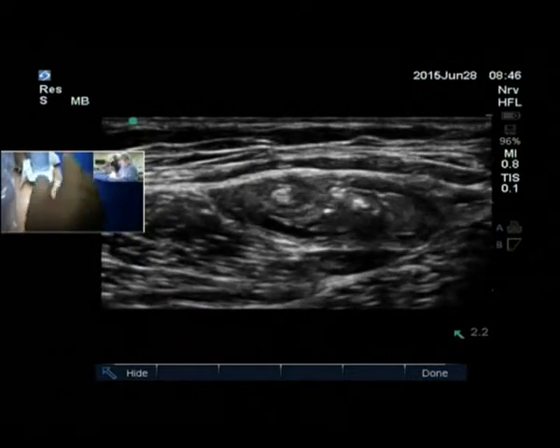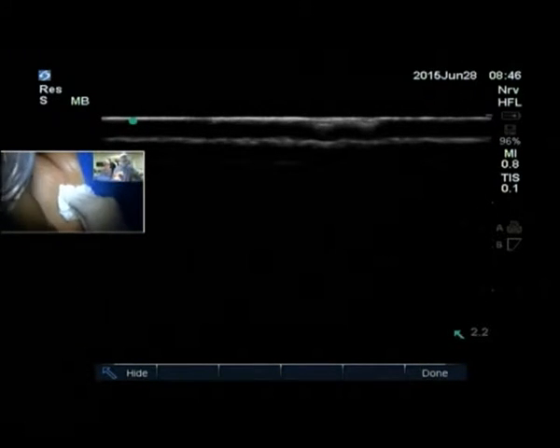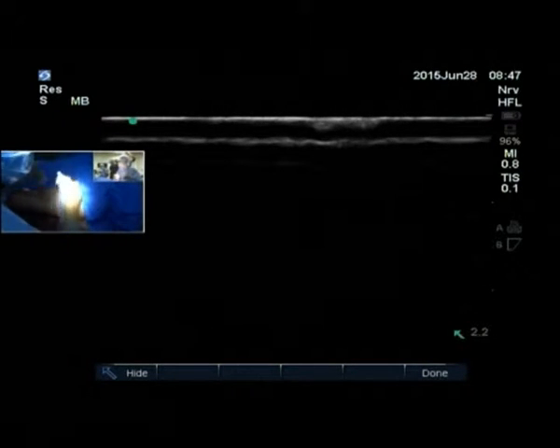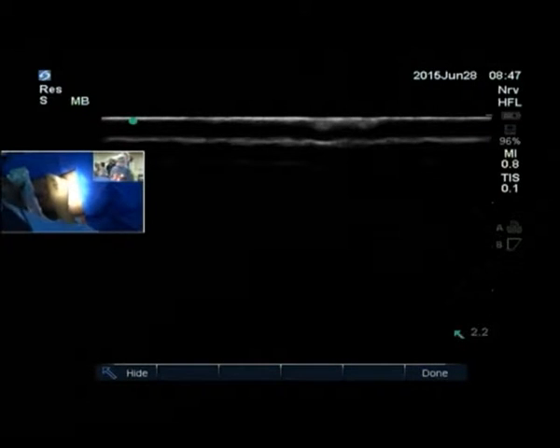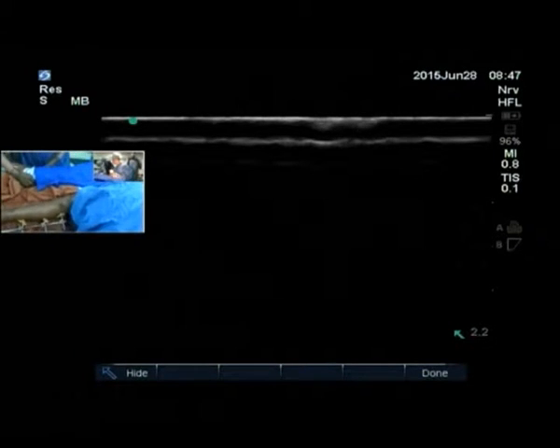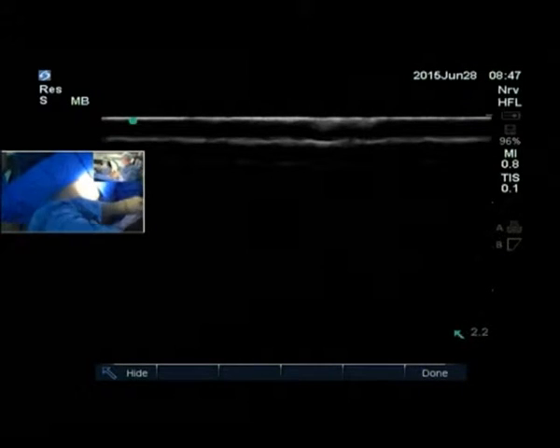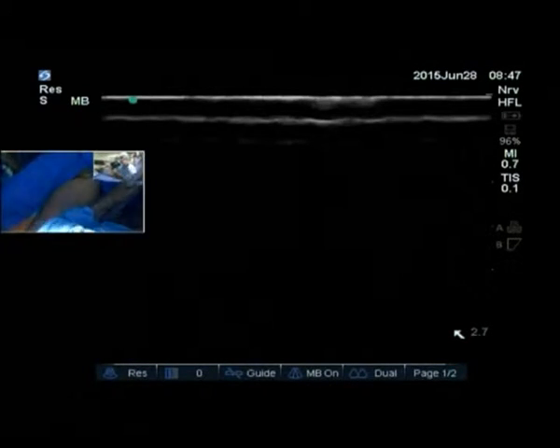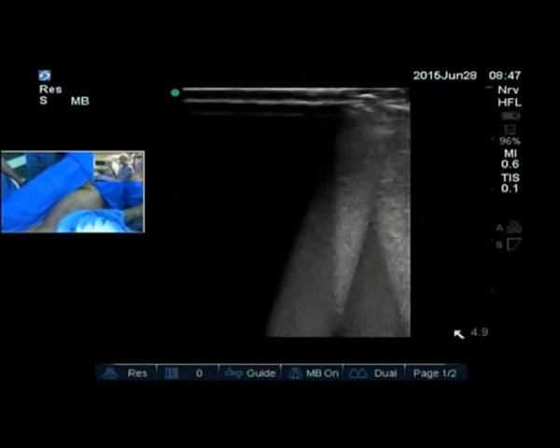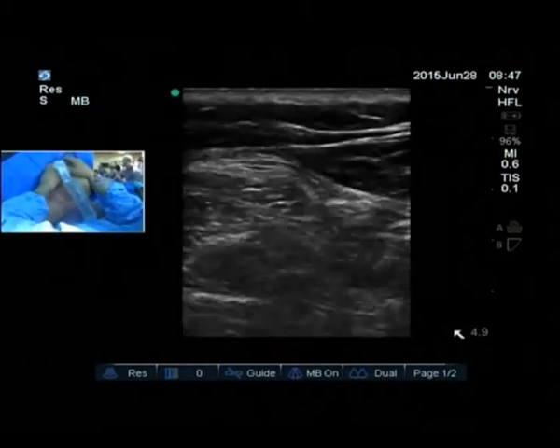So now we look at the obturator. The obturator will usually have the leg abducted a little bit to the side, so we have a little bit more space on the medial side of the thigh. And I use a little bit more gel and a bit more depth. For her, we pre-scan it. It's a very nice adductor longus, brevis, and magnus. So we look at the intermuscular fascial plane.